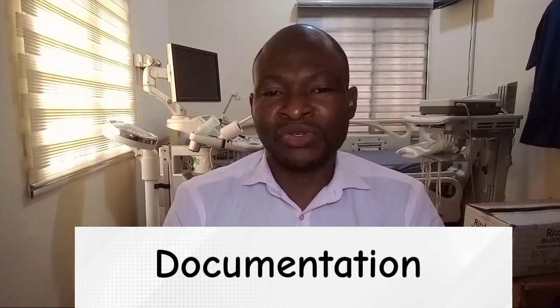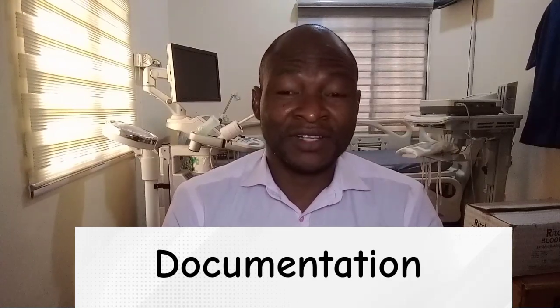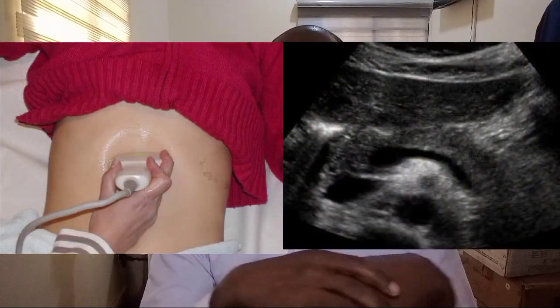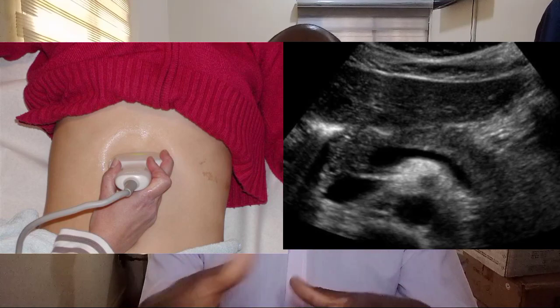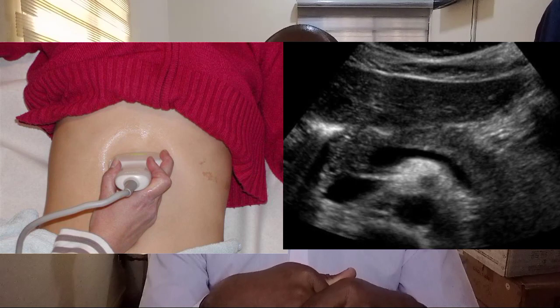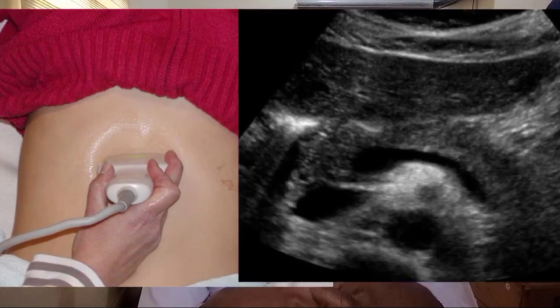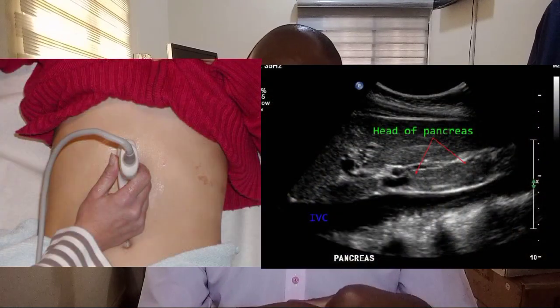So basically, when you do your documentations, document normal anatomy. Any pathology found should have been discovered in 2 planes, and also include measurement and any vascularity you see when you are making documentations. So this image shows you the scanning planes for a live patient and also the ultrasound image. So this is transverse, and that's how you place your probe, and that's what you see on ultrasound.